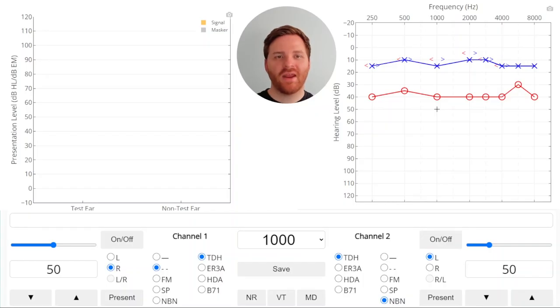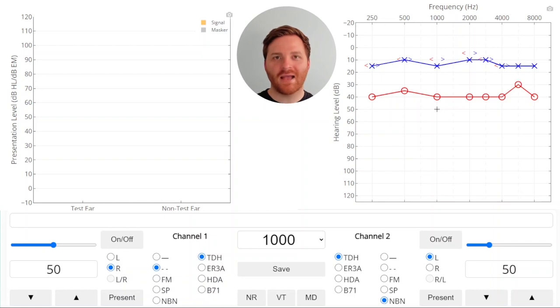Check out this case I made in Theta. On the right side of the screen, you see unmasked thresholds for air conduction and bone conduction in the right and left ears. On the left side, you have the masking tool. The masking tool shows you the level of the signal and the level of the masker in the test and the non-test ear.